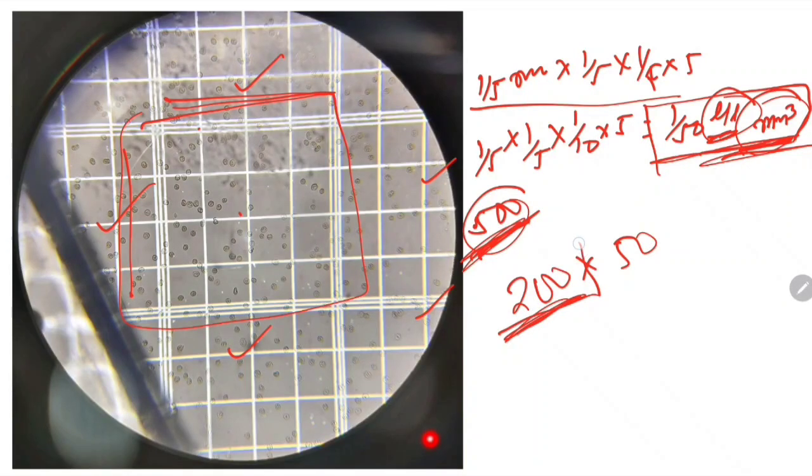So for that dilution factor we have to adjust, and into 200 we have to do, because dilution is 200 times. And here the total number of RBC is represented per microliter or per millimeter cube, but here we are not going to count even 1 microliter, very less. So for that we are going to count 1 by 50 microliter volume, and that volume is not whole blood but diluted blood.